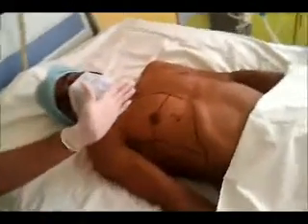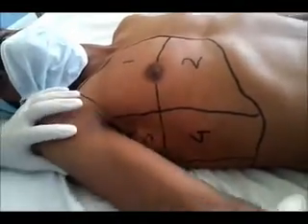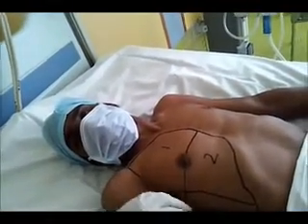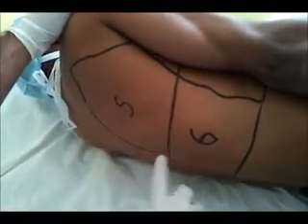For a thorough and complete ultrasound examination, we have divided the chest into six parts. Anteriorly, it is divided into zone 1 and 2, laterally into zone 3 and 4, and posteriorly into zone 5 and 6. Zone 1 and 2 are separated by a line through the nipple. Zones 3 and 4 are between the anterior and posterior axillary lines, and zones 5 and 6 are between the posterior axillary line and the vertebral column.